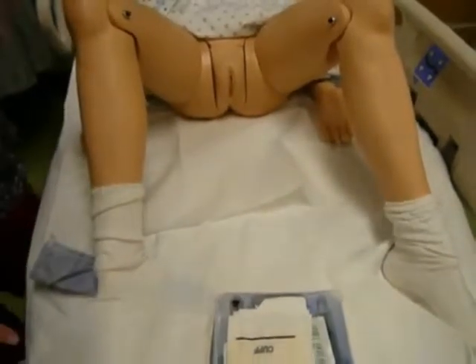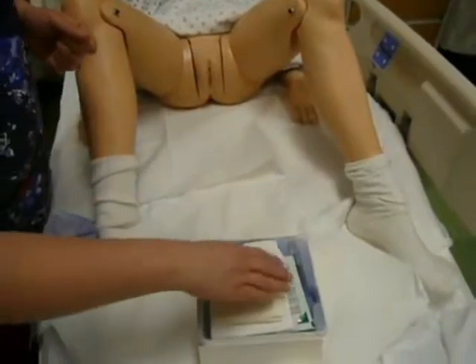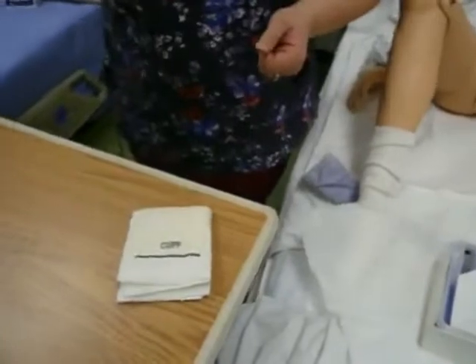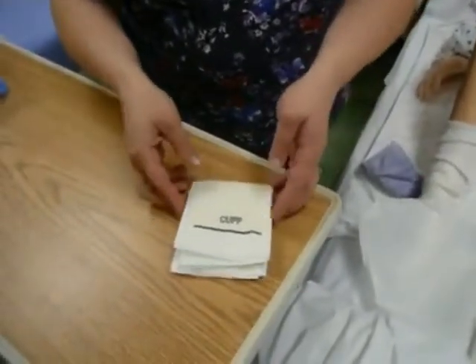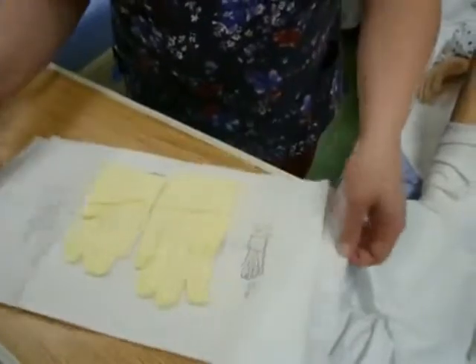Now I have a sterile drape between the legs along with my sterile field. The next thing I'm going to do is take my gloves out of the kit and bring them back to my bedside table, which means that I don't cross over my sterile field. And I'm going to put my gloves on at the bedside table.